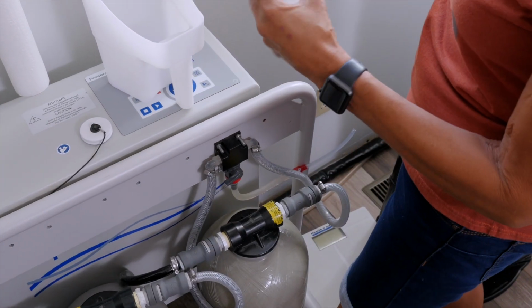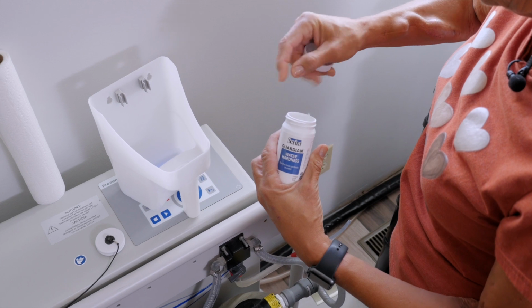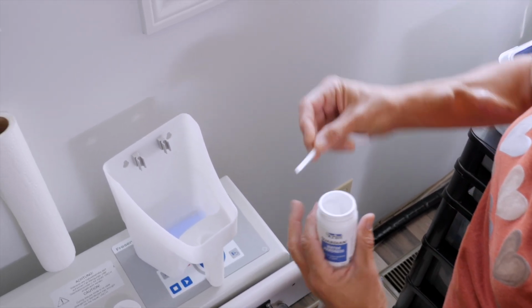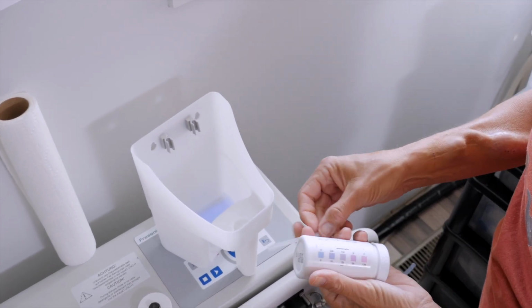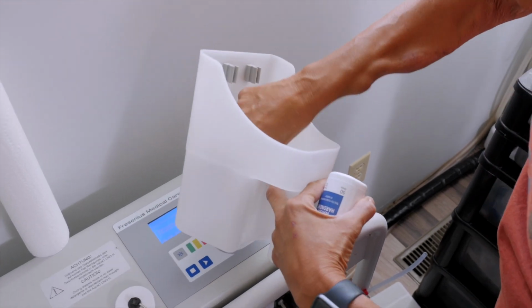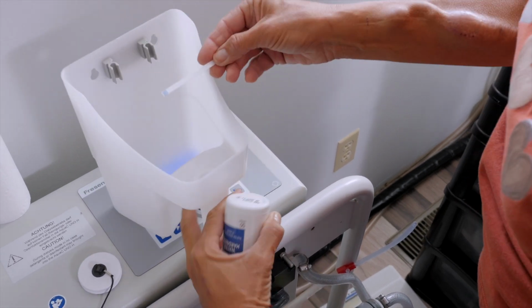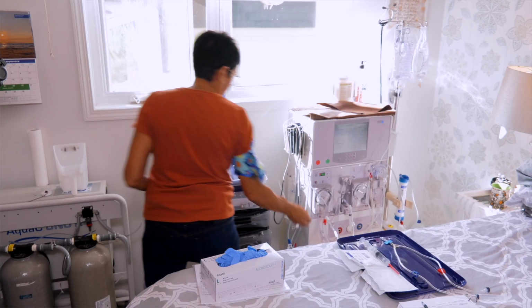So we get the water hardness test strips. And it'll show on the side what color there should be. It should be a blue. Starts out as blue, so it shouldn't change. You can see it's stayed the same, so it's good. My water hardness is good.